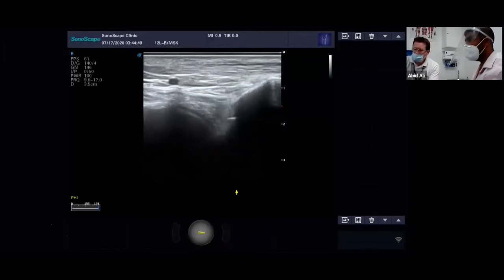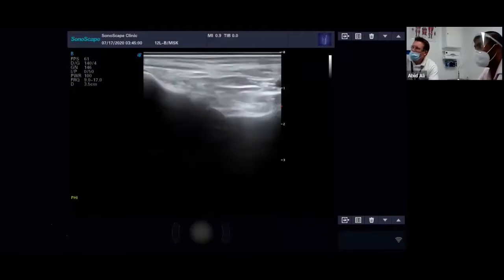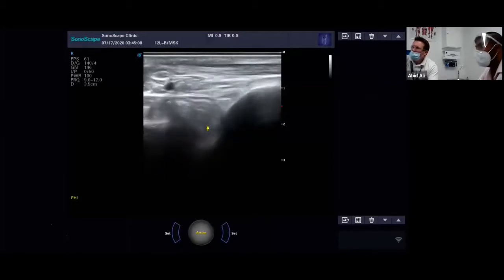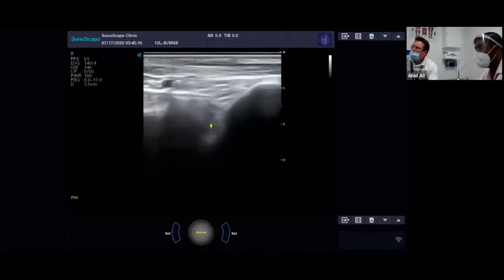It's not the best bony image, but it probably needs adjusting. So Adrian's going to show you, if we were to see an effusion, we'd see a big black cloud, just where Adrian's marking with the cursor. And actually, if you were to dorsiflex and plantarflex the ankle, should we just do that for them? Okay, let's dorsiflex, Adrian. I'm going to keep my probe on it. So you can see the soft tissue in the ankle mortise, where if there was an effusion there, you'd see a big black lump of cloud type of shape moving up and down. It really does kind of bobble out.